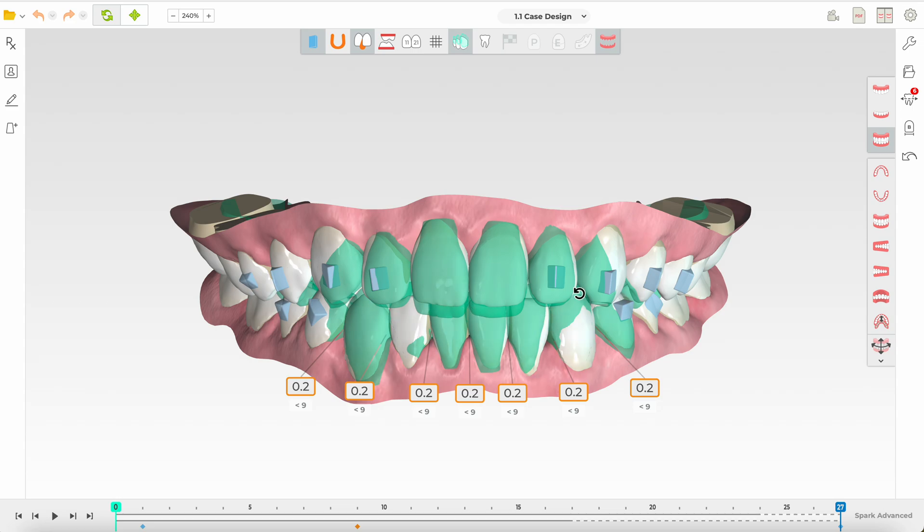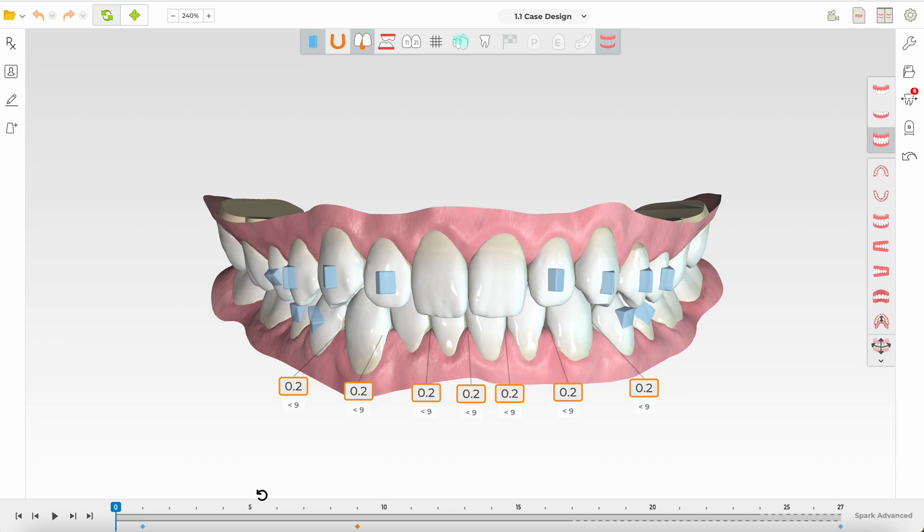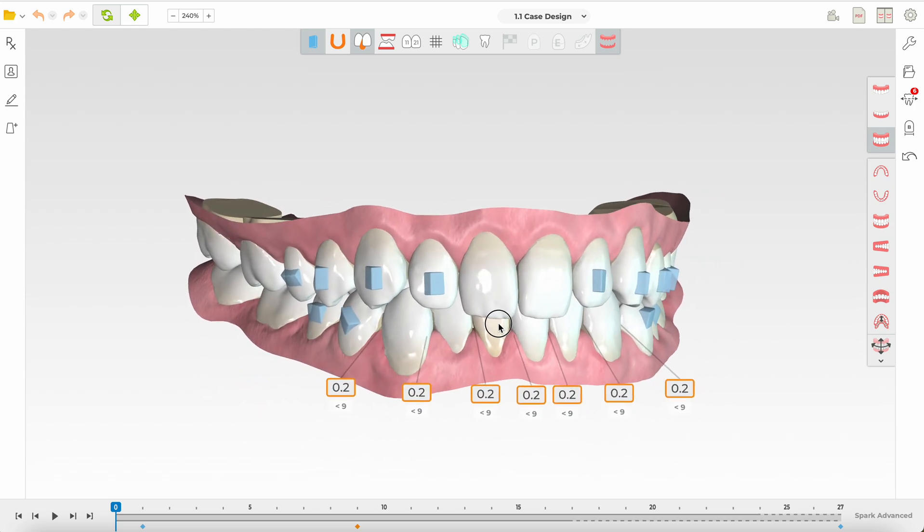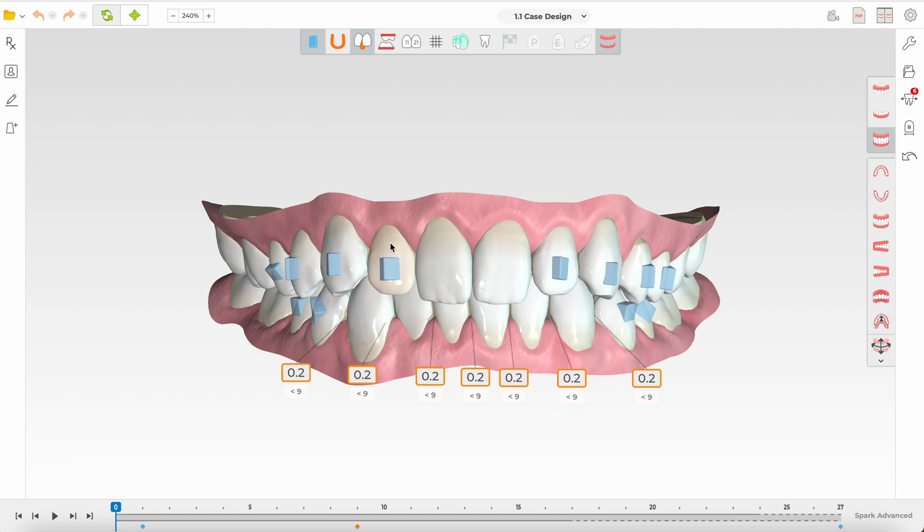That intrusion was probably based on a rationale of reducing gingival display on smiling. However, this is not a deep bite case, so there is no need for intrusion of the upper incisors. In fact, you want to maintain the vertical heights where they are — it's fairly symmetric. If anything, you would only slightly intrude the posteriors and maintain the upper 1-3 to 2-3 gingival heights that are near ideal.